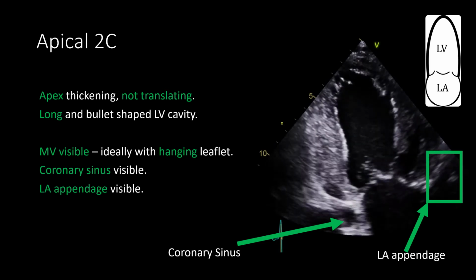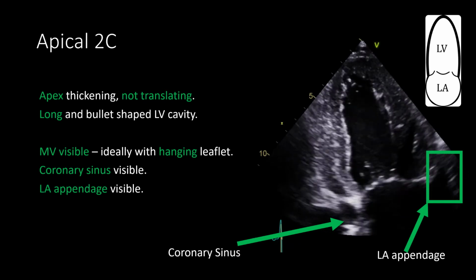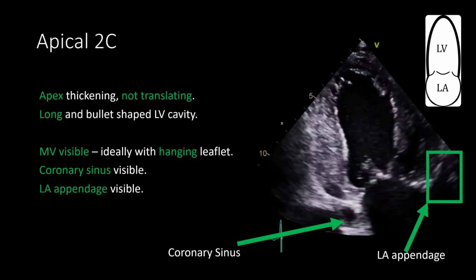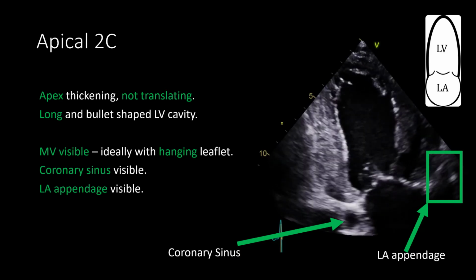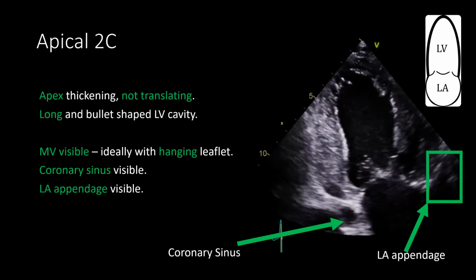This means that we have two slits in the mitral valve, representing the posterior leaflet circling the tip of the anterior leaflet floating in the view. The coronary sinus and left atrial appendage help standardize and confirm the appropriate rotation further, but are not always seen.